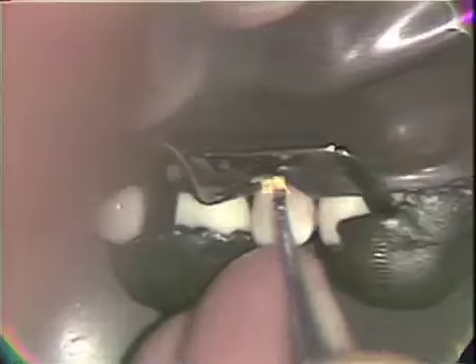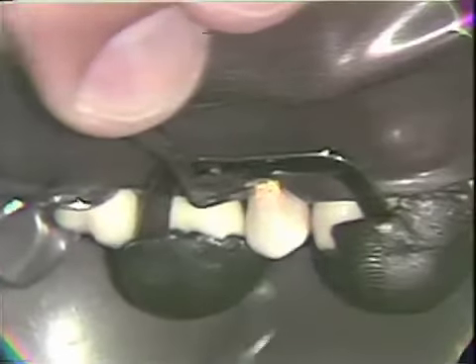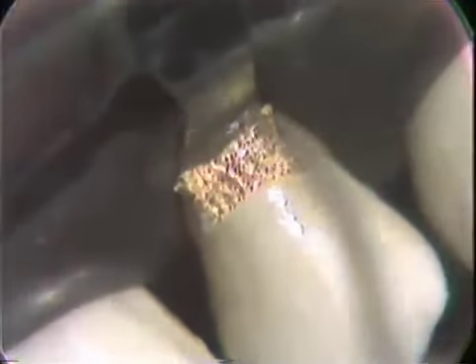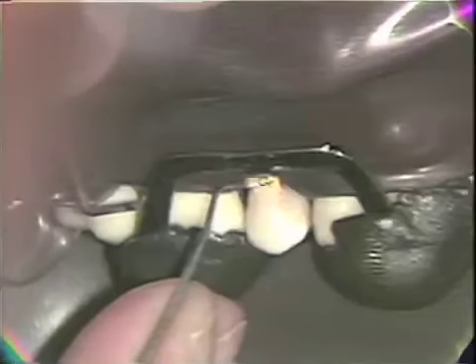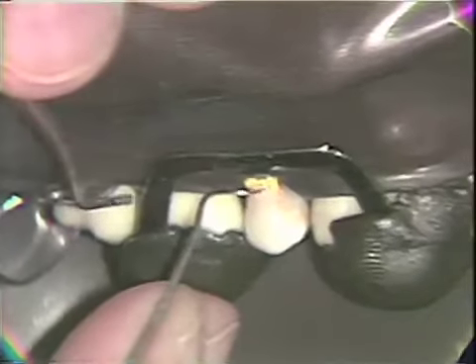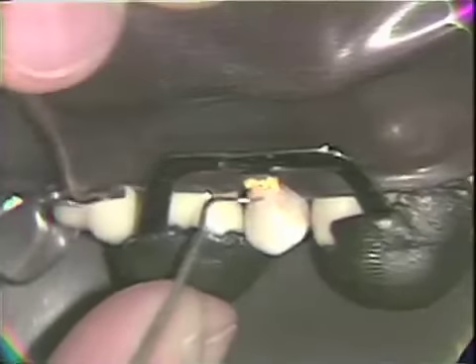So we'll continue then, now that we have this material locked into the retention, and it's well perhaps at this moment to assure ourselves of that locking, taking even an explorer, removing the instrument and trying to dislodge the gold. We see that it is locked into place. We'll continue now to bring about condensation, building this in a depressed axial wall, condensing against the margins of the preparation until we have the preparation completed and can then think of the contour.